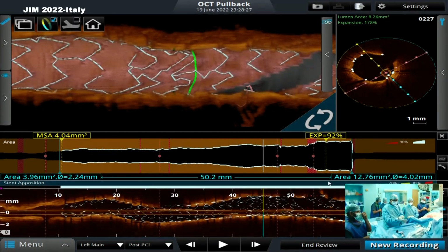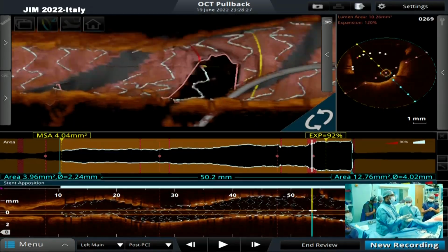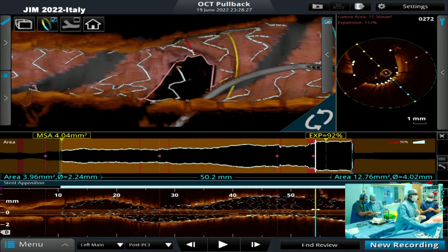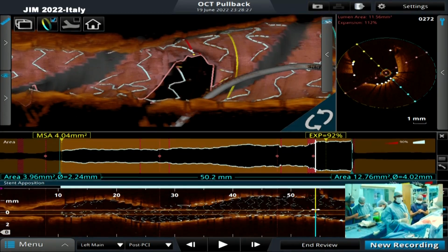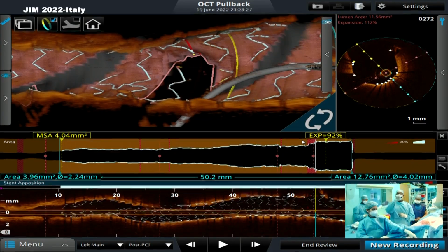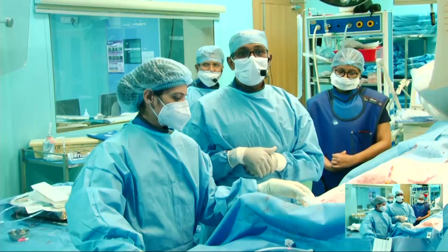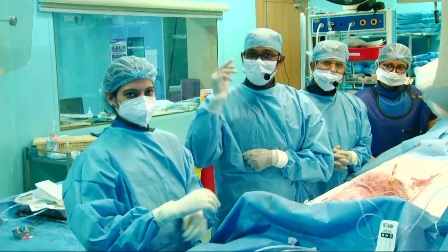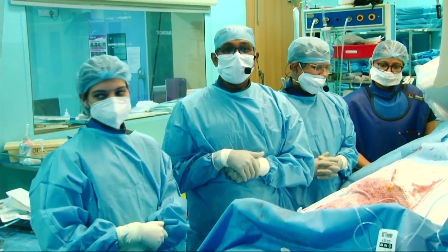Would you want to do something more? We thought we should stop the procedure with some nitro final shots and stop the procedure. We can definitely stop the live case, but that is part of the procedure. That's great. You did a tremendous job. Enlarge the result, cameras. You are able to handle all the difficult questions we ask you in a tremendously charismatic way.